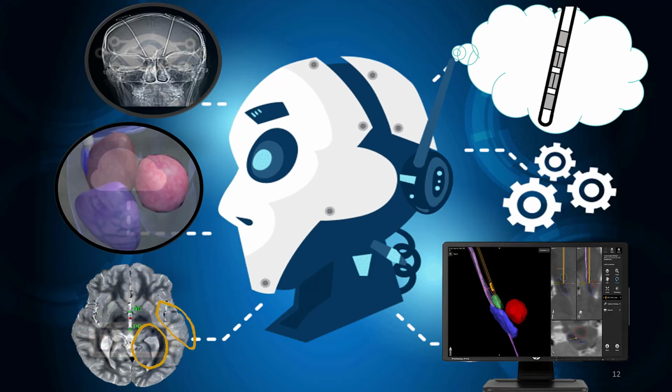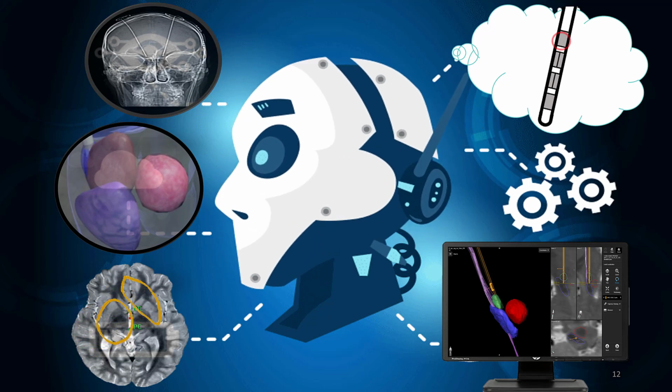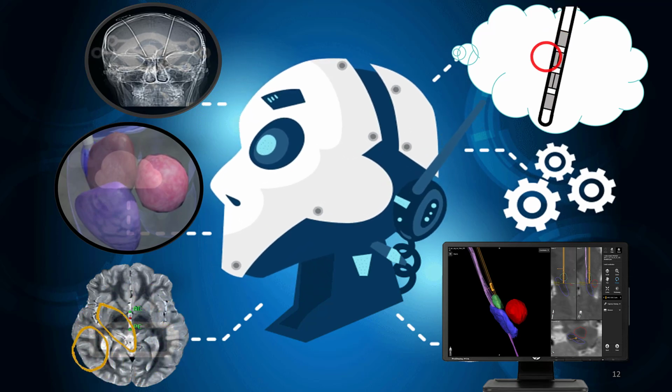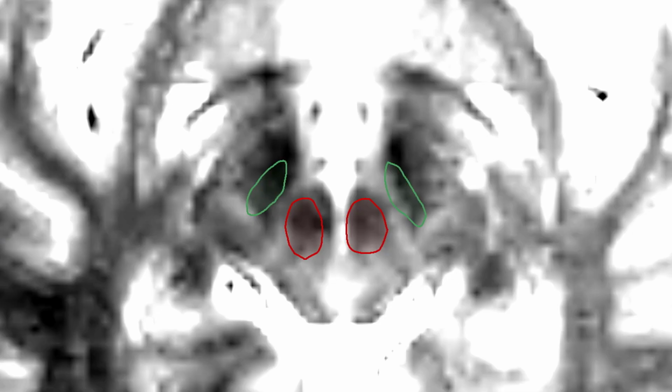And finally, it helps us to understand how to optimize the VTA in relation to the local anatomy. In the navigation system, the anatomy is mapped and analyzed with artificial intelligence based on various algorithms, but a model is always a model and not a reality. Sometimes there will be a more or less perfect fit between the model and the gross anatomical reality. Often it is good, but sometimes there are considerable deviations.